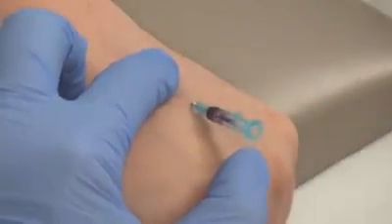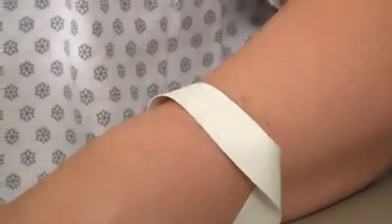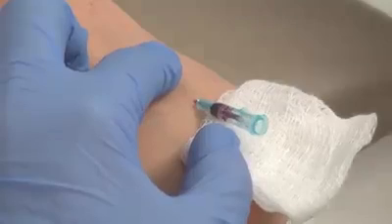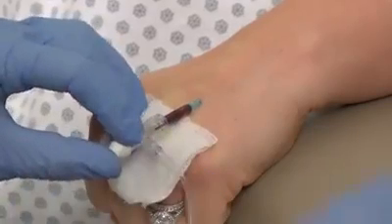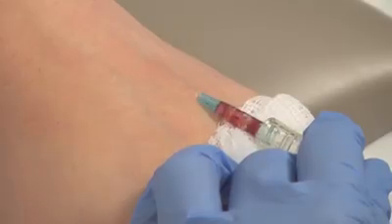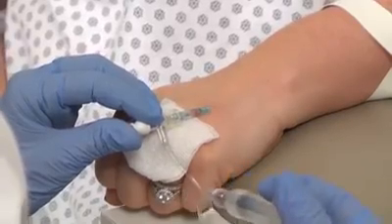Separate the angiocath and the needle. Apply pressure at the insertion site to minimize bleeding, and release the tourniquet using a one-hand quick release. Apply the saline lock by twisting the saline lock onto the angio. You can place a piece of gauze underneath to catch any blood. Then flush with saline. While flushing, observe the site for any redness or swelling. Watch the patient for any signs of pain and ask them if it feels okay. Remind them that it may feel cold but should not hurt.